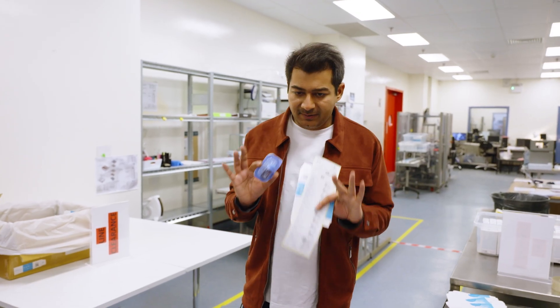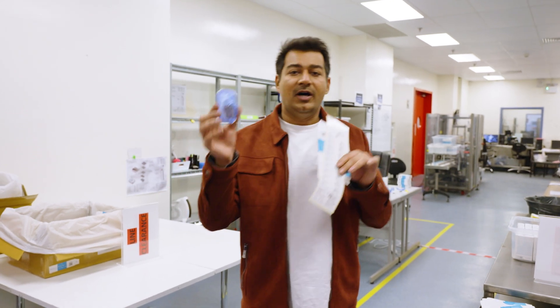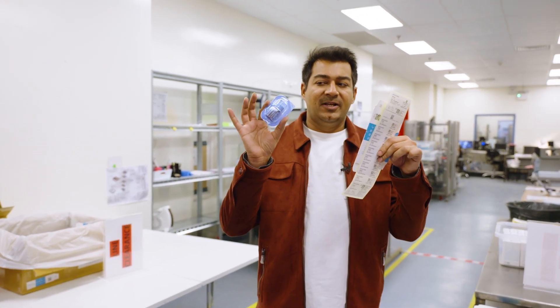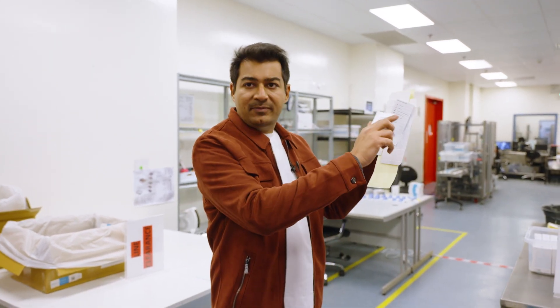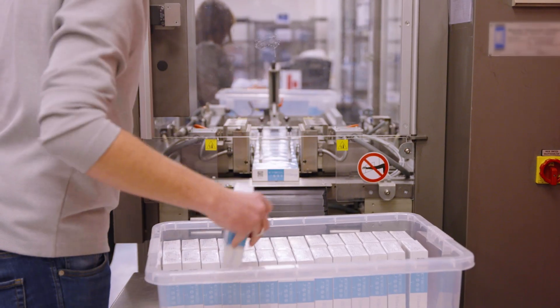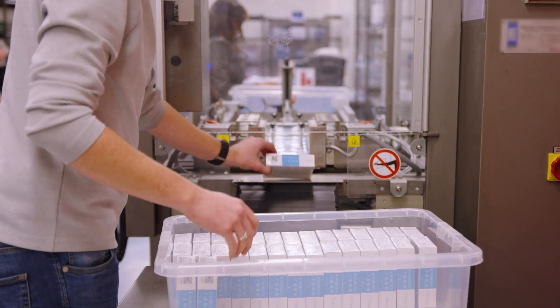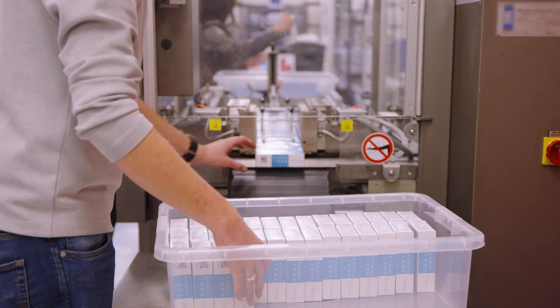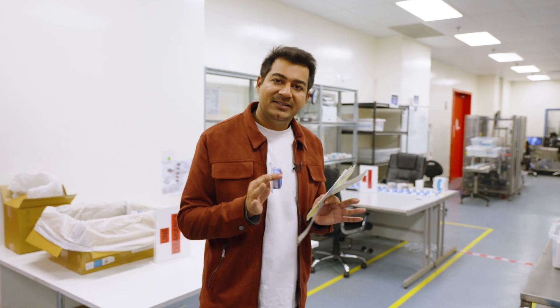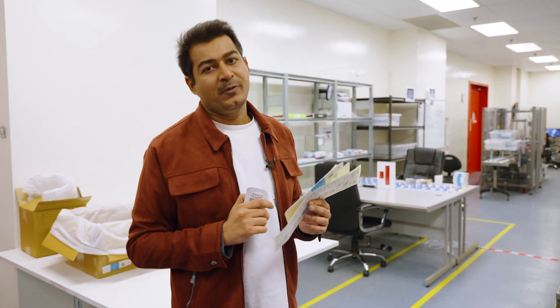Once the sterilization process is complete, the lens is now packed. First there is a basic packing of the lens, and after that it is placed in a box with proper labels and proper instructions. A final pack is ready, which is then sealed and kept in stock in inventory. After that, whenever an order comes from anywhere in the world, the lens is taken from inventory and shipped out.